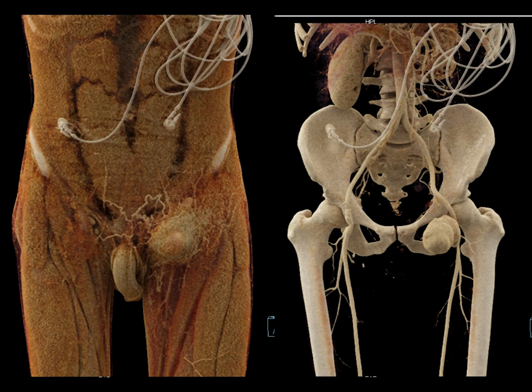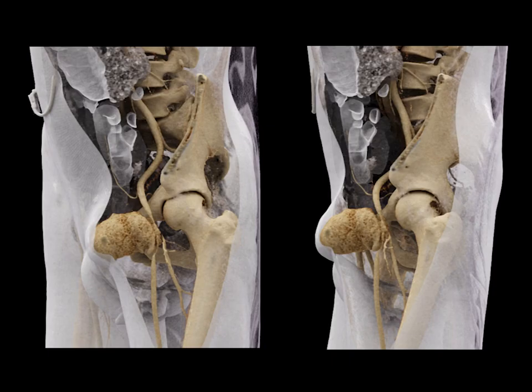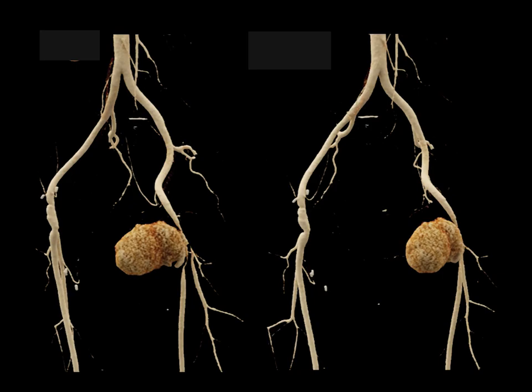And now I do the same data sets with cinematic rendering. Look at the induration, the soft tissues, the mass in the groin, the relationship with the skin and muscle taken away on the right, showing you just the pseudoaneurysm. And then when I render the data set with cinematic, and I put the skin back, you can see the pseudoaneurysm pushing on the skin. You can see the narrowing of the patient's femoral artery and superficial femoral artery due to the compression by the pseudoaneurysm. Again, 1,000, 2,000 images shown in 1 or 2 images, which gives you all the information.